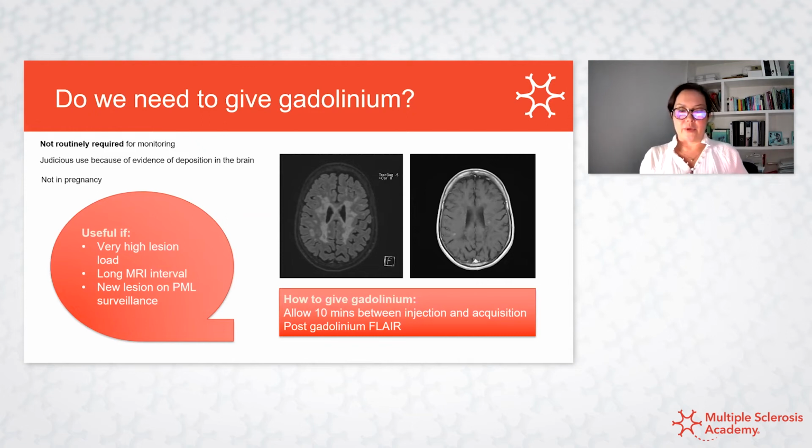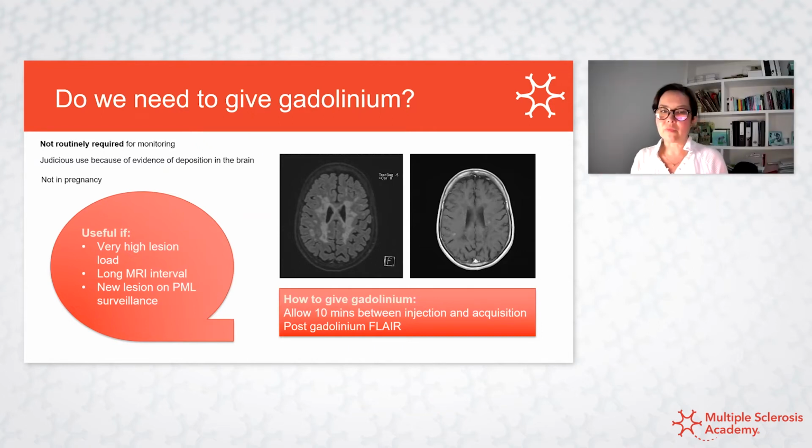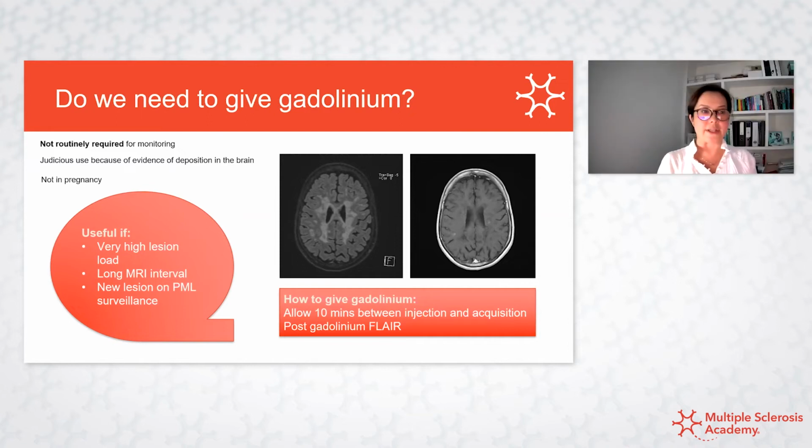And we allow a 10-minute gap as well, so that you get good concentration, so that you've made the most of that gadolinium dose. For radiologists, Audrey, that's quite a lot of extra time, isn't it? That's a person with an acute stroke you can't get through in that 10 minutes. Is that right? So yes, good point.